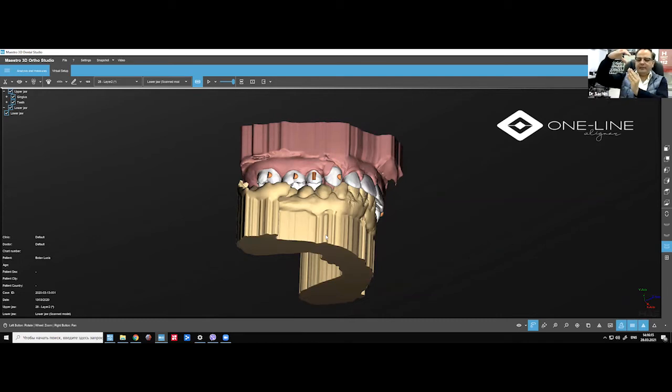One of my friends, who also works with aligners a lot, says that in his way of working, he can get extrusion of anterior teeth of around 0.8, 0.9 millimeters. I've tried that. It didn't work for me. He says if the foil covers the entire tooth surface until the gingiva, then the cervical part is very retentive, which is good for us.